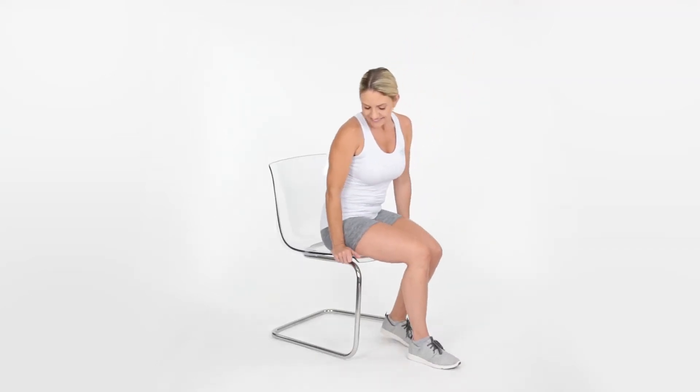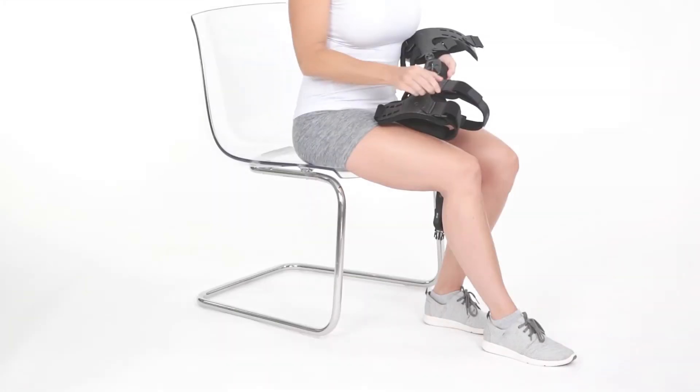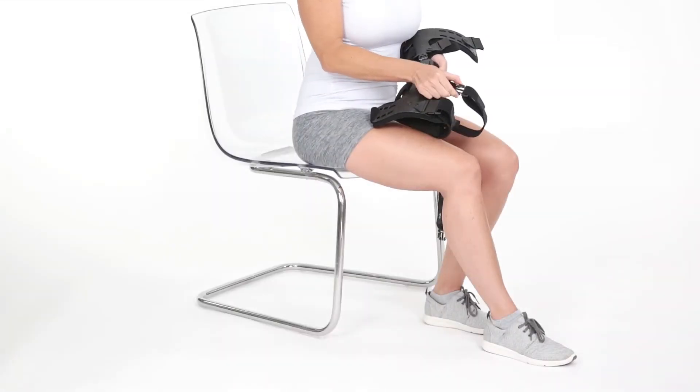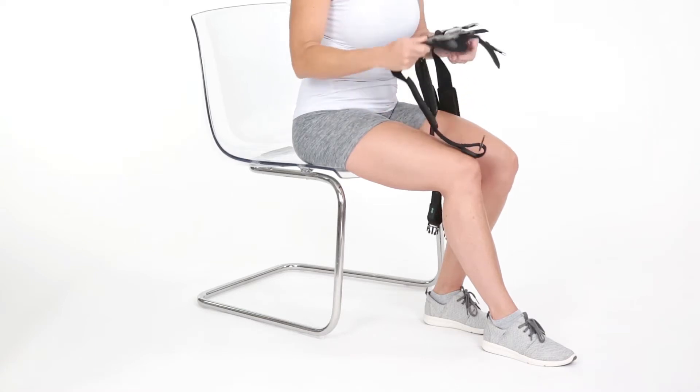Sit at the edge of a chair with your knee slightly bent and foot flat on the ground. Loosen and undo all straps, then place the brace on so that the hinge lines up with the outside center of your kneecap.